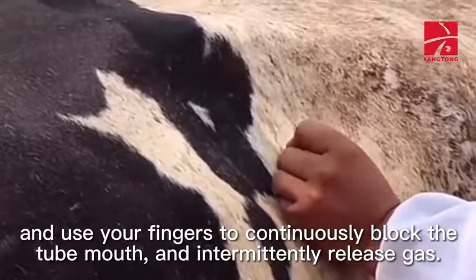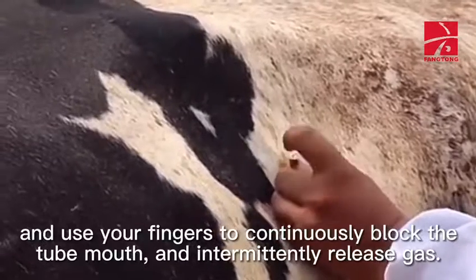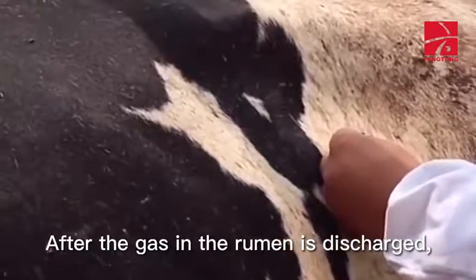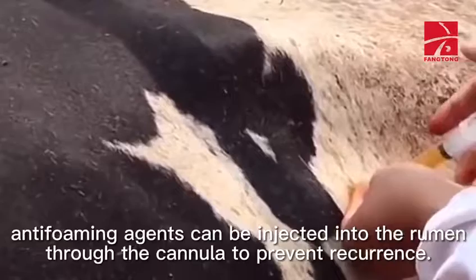At the end of the procedure: after the gas in the rumen is discharged, antifoaming agents can be injected into the rumen through the cannula to prevent recurrence.